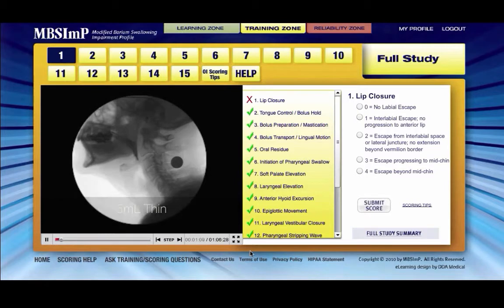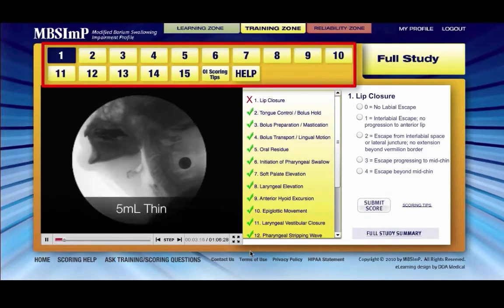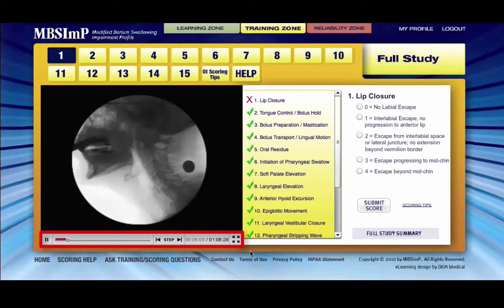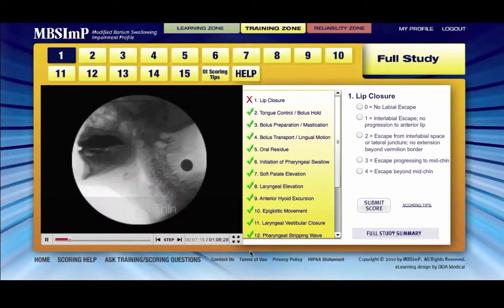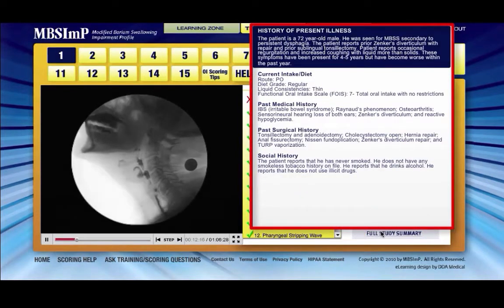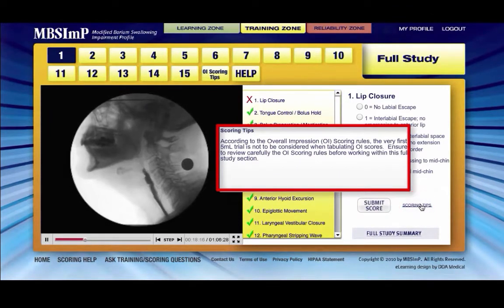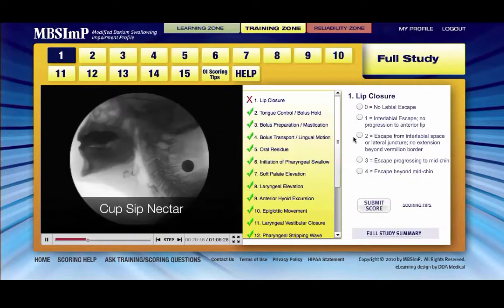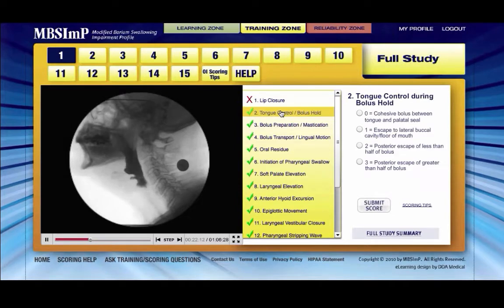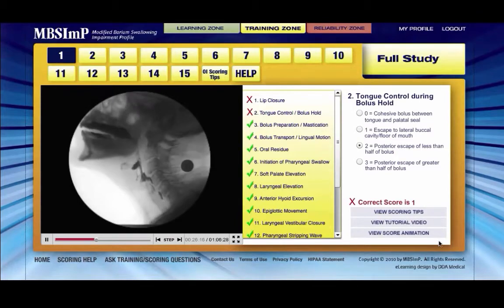Working within the full studies functions similarly to the single swallow studies. 15 high-resolution full protocol studies are accessible at the top of the screen. The media window and player controls function the same as in the swallow by swallow section. Bolus trials are labeled within the full protocol itself. Passing the cursor over the full study summary link reveals a brief medical history specific to the selected full protocol study. Likewise, hovering your cursor over the scoring tips link reveals scoring guideline reminders for certain components. Choose the desired component in the list next to the media player and the associated scores will populate to the right. Select the score of choice and submit. Feedback is immediate and states the success of a choice.